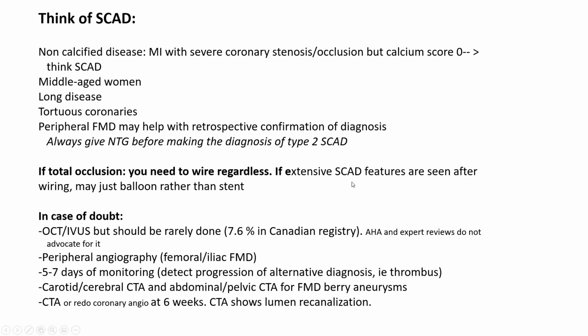But if extensive SCAD features are seen after wiring, you may just balloon rather than stent. So even if total occlusion, you may stop after wiring, maybe after wiring and ballooning, just after establishing the flow. So you need to know the features of that, even in total occlusion, whether upstream features ahead of the occlusion or features that appear after you open the occlusion.